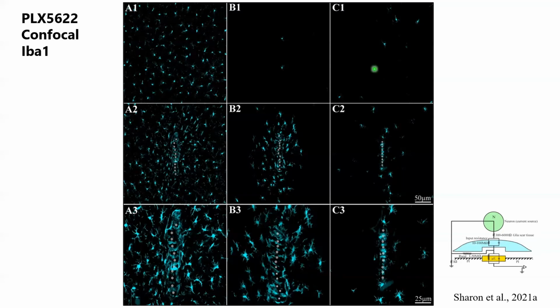And in anticipation of a question, how does it affect the behavior of a rat? I will tell you that this did not affect the behavior of rats nor mice. This removal of microglia from adult female rats' cortex significantly reduced the participation of microglia in the foreign body response scar tissue. Unexpectedly, we discovered a Plex-resistant cloud of microglia in the narrow shell, less than 25 micrometers away around the implant surface. In addition, and unexpectedly, we also detected a subpopulation of microglia that remained adhering to the platform.